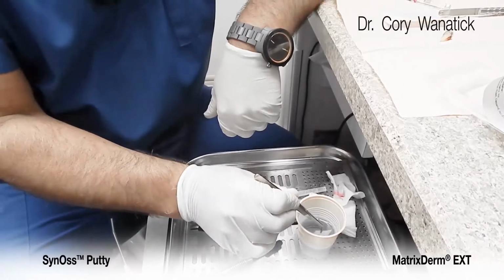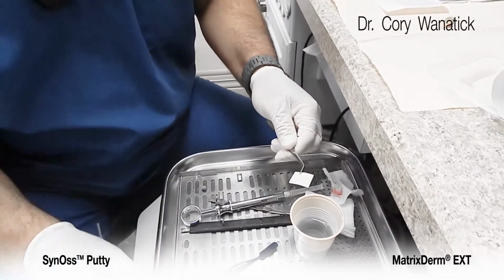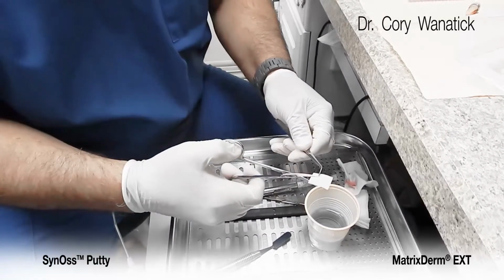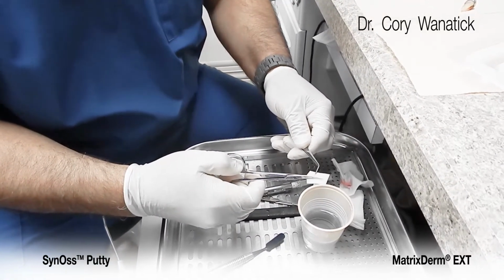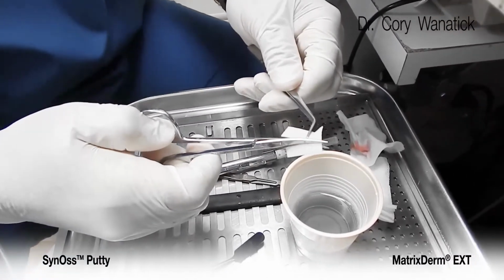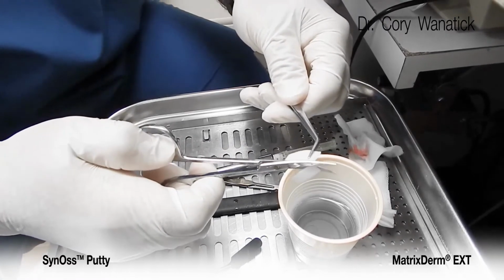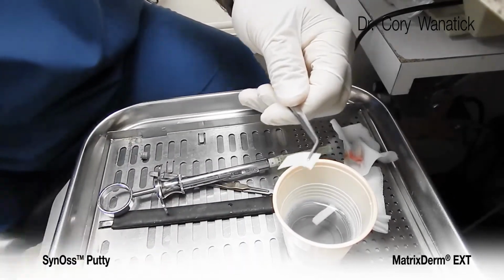Alright, we've let the collagen membrane hydrate for approximately 1 minute. Now we're going to take it back to the site and place it. I'm just going to slightly trim the membrane so that we can place it under the flap so it doesn't bunch, and fit it to the site.